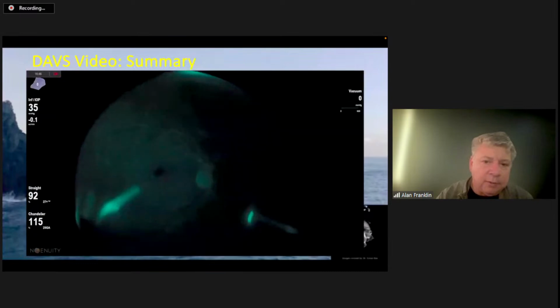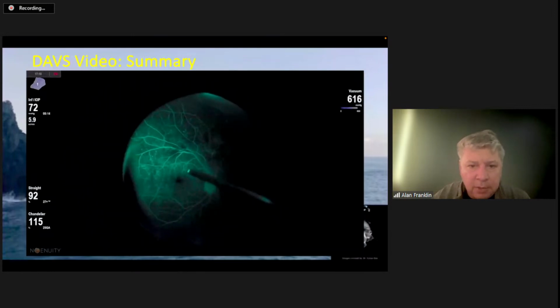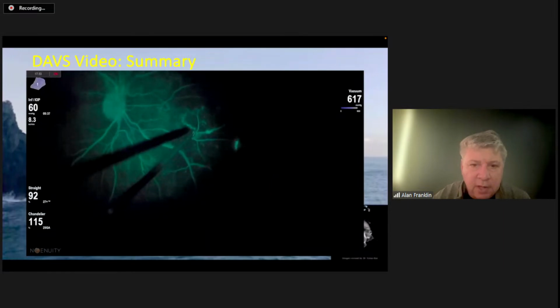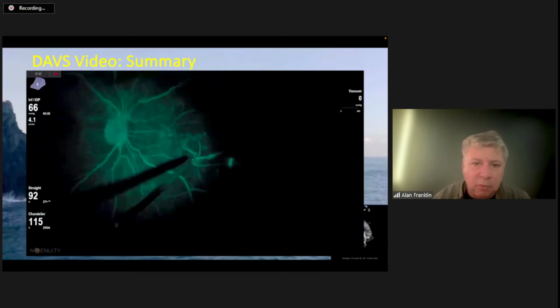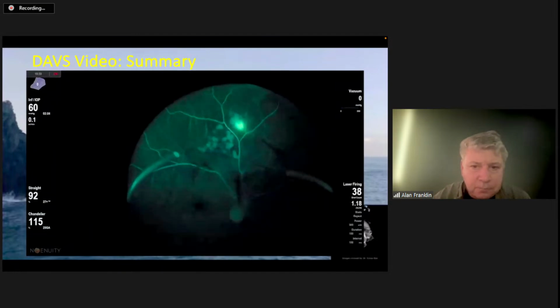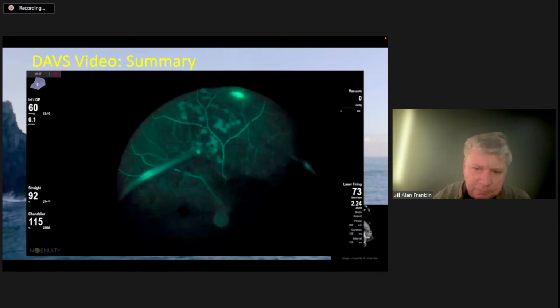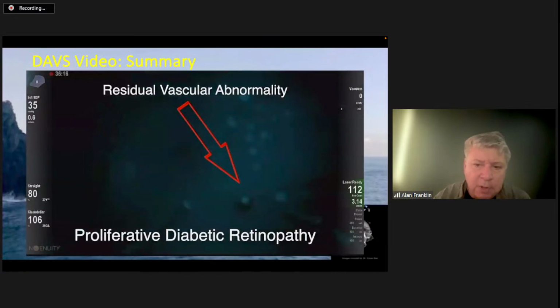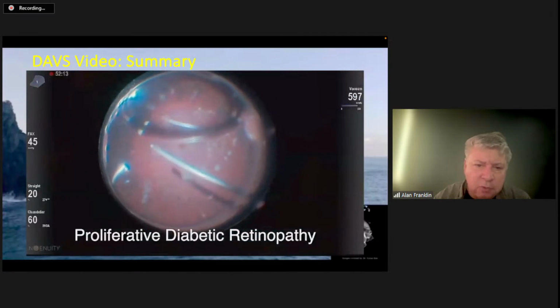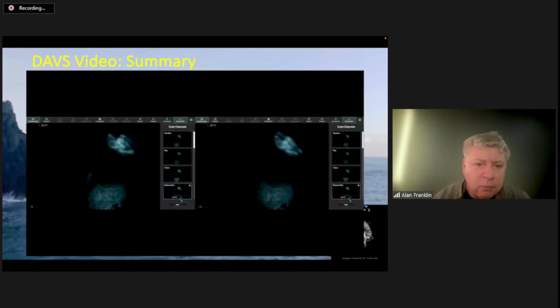In terms of the visualization, I've got a few cases here. This is a diabetic, and it's really transformative to see how well you can see in these eyes. So some residual neovascularization, just a little bit that we're peeling off. Then the ischemic retina that we saw earlier, we're applying heavier laser to the ischemic retina while sparing the less ischemic retina. This is a RAMA, and with fluorescein, you can really see the extent of the RAMA. These are some residual leaks that oftentimes you don't see after you do a peel, and we're treating those, and we're getting good results with this.